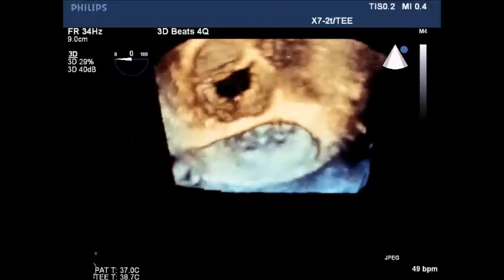TEE showing 3D normal aortic and mitral valve with color flow Doppler.